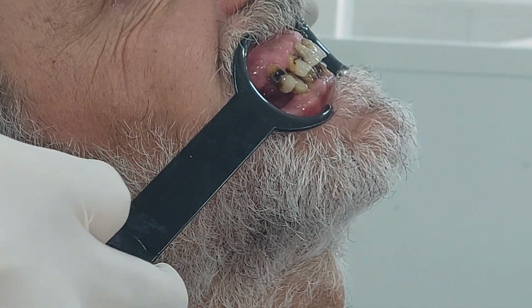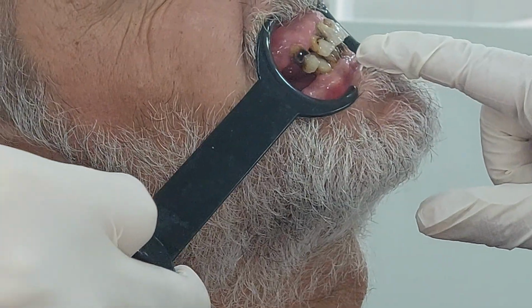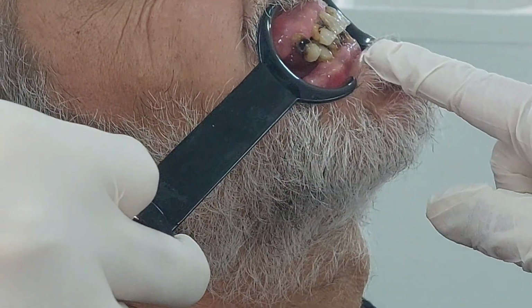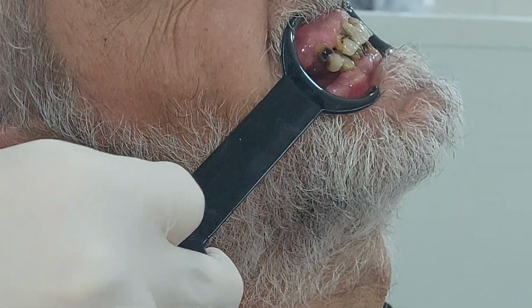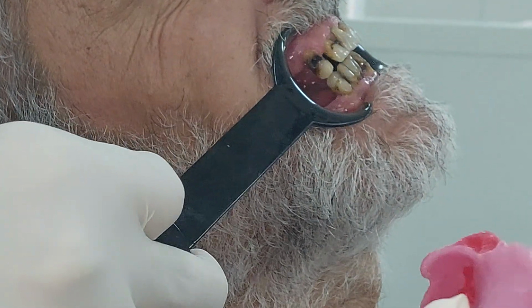This is a case where we are dealing with an interim restoration. The student is going to follow up the patient for caries and other issues, but we're concentrating on the occlusion using partial dentures. Okay, doctor, you said you're going to do upper and lower. Yes, upper and lower partial dentures. This is the bite naturally. Okay, we're going to replace. We are in the jaw registration and we're deciding on the occlusal height, the occlusal position, and the wax registration.